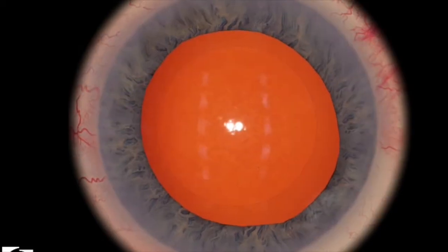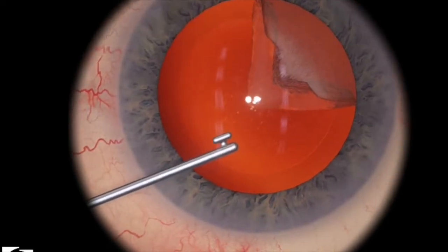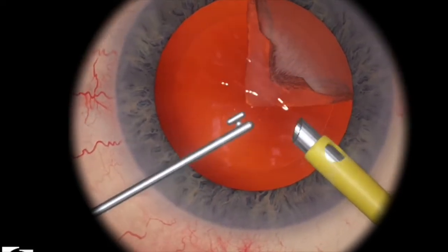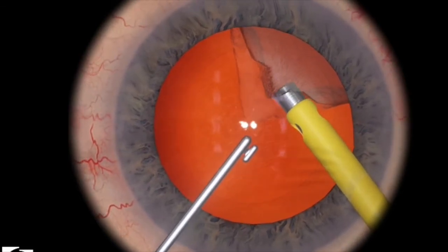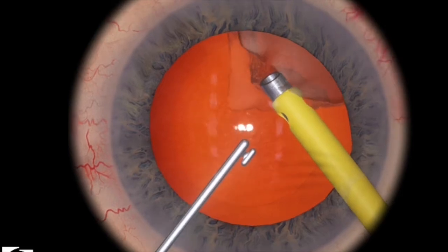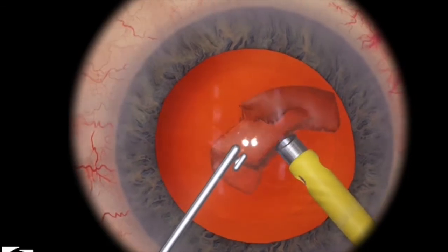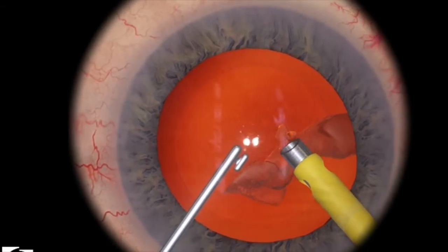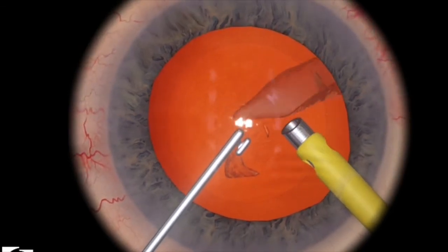So let's try that one more time. Here I've put in my secondary instrument, I put in my phaco tip, a little bit of aspiration. Now I'm just using a little bit of ultrasonic energy, bringing the remaining pieces into the center, and then just using the rest of the ultrasonic energy to consume the rest of the pieces.